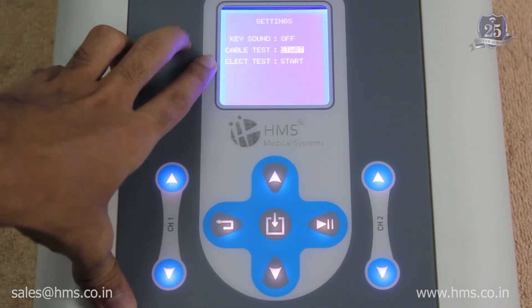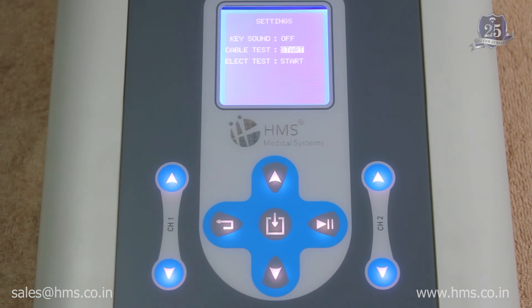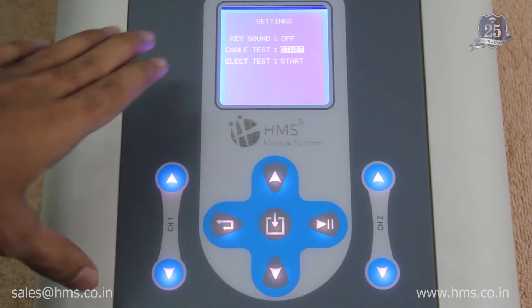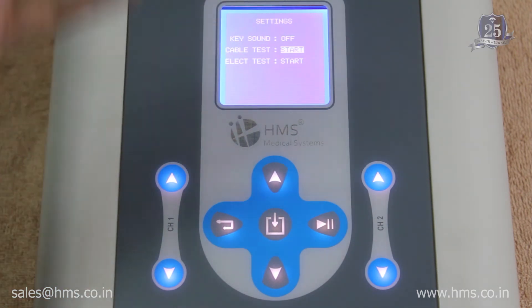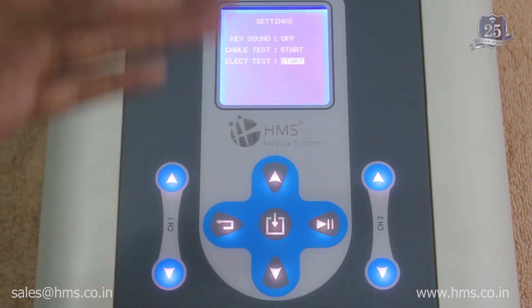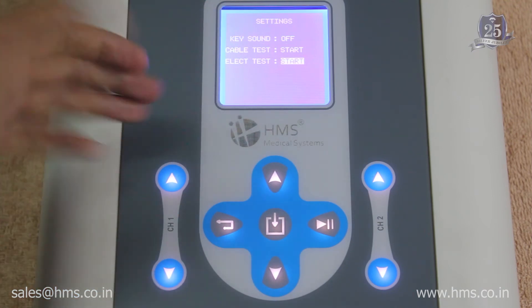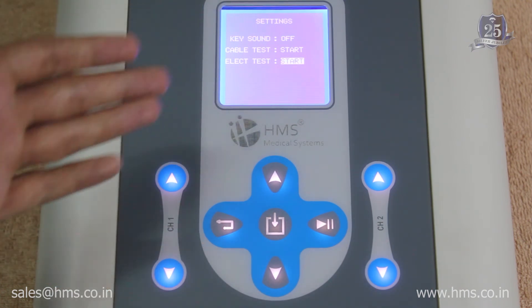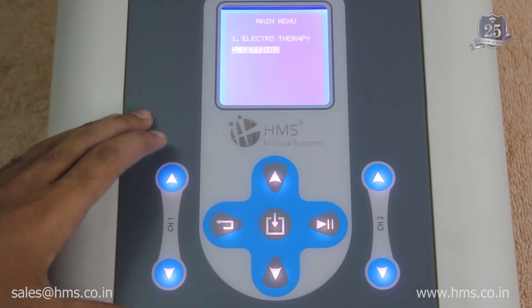The settings also include two diagnostic modes: cable test mode and electrode test mode. Cable test mode checks whether your cable is intact and free of wear and tear — if there is poor conductivity, it will indicate an error. Electrode test mode checks the conductivity of the electrodes, since conductivity can decline as electrodes age. These are very useful features for checking the condition of your accessories.